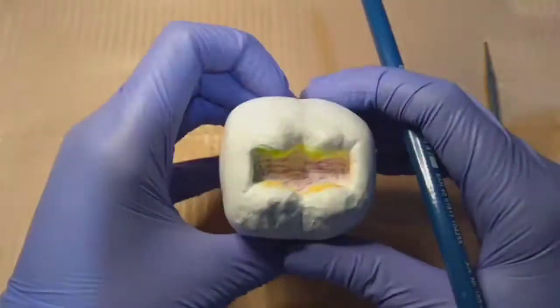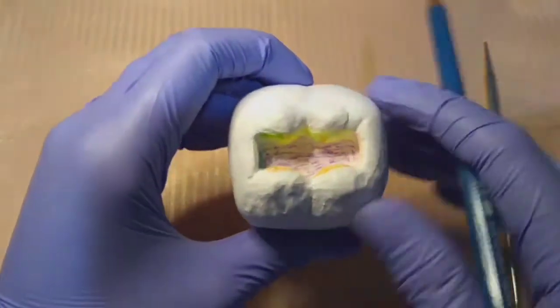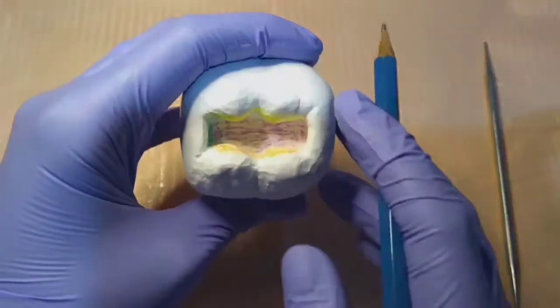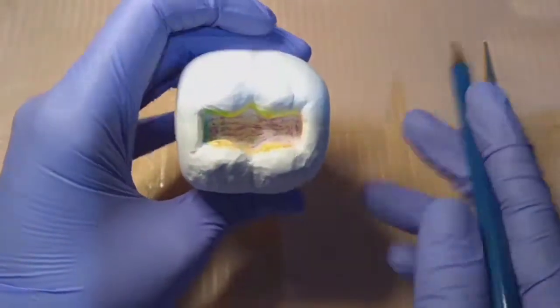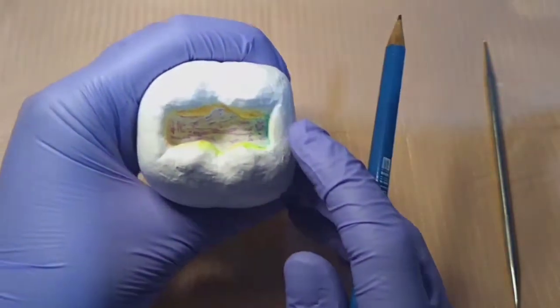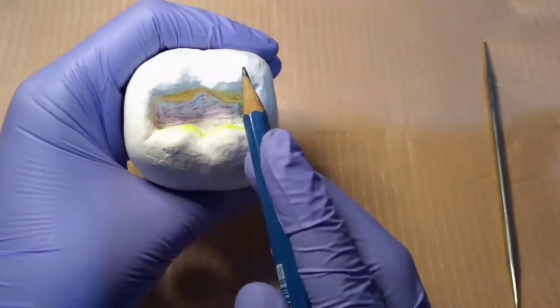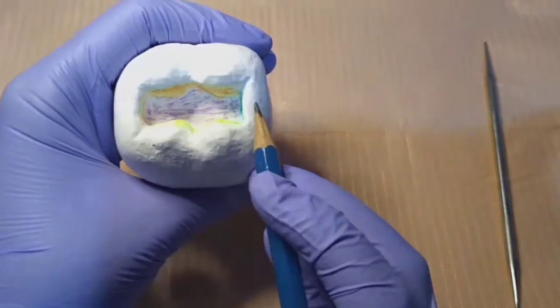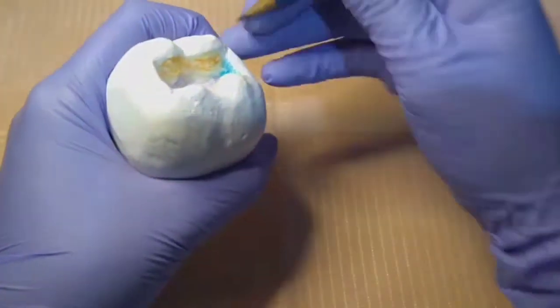So for the point angles, by the way, point angle is formed by the junction of three surfaces. So we have 4 point angles in a class 1 cavity preparation. Now, we have here the buccal wall, then the distal wall and the pulpal wall, which form the disto-bucco-pulpal point angle.